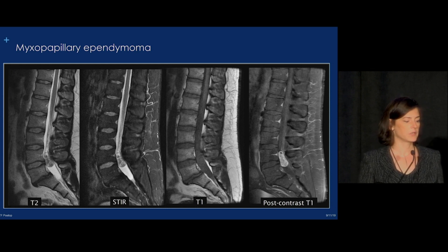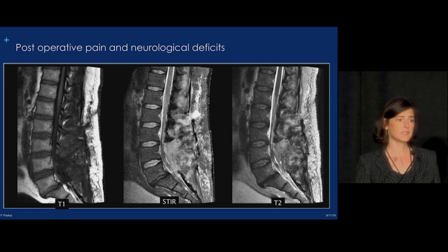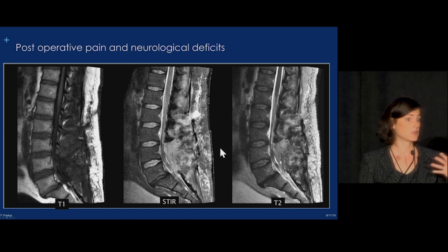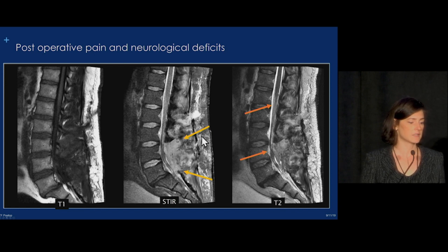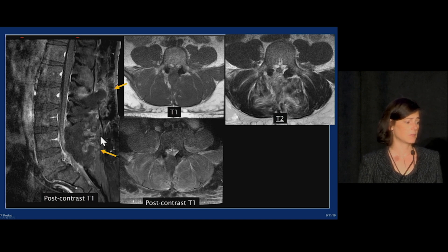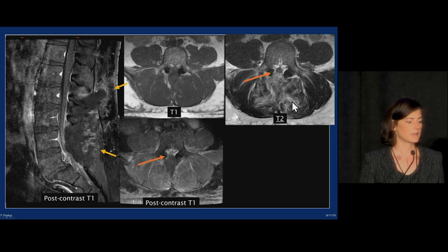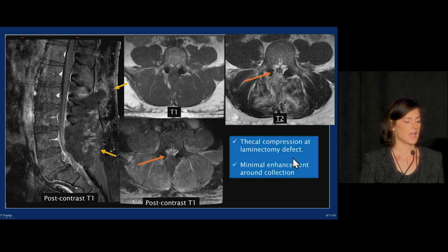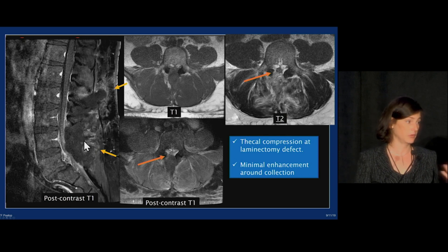Here's a patient who presented with a myxopapillary ependymoma that was resected. Postoperatively, they had pain and neurologic deficits. On MRI, there's a large laminectomy defect with material in it. The conus looks fine but the nerve roots are bunched together. On post-contrast imaging, this is an ugly-appearing resection, but enhancement around early post-operative sites is completely normal and can be quite florid. The critical finding is material extending from the resection cavity into the epidural space, compressing the thecal sac. The patient was taken back to OR urgently, and this was all epidural hematoma causing mass effect.